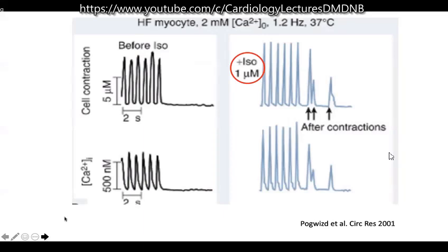Similarly, if you have a patient where the PVC is happening very late after the T wave, in a person who is on dobutamine, 9 out of 10 times, that is delayed afterdepolarization. You are giving too much dobutamine or too much digoxin, and it's calcium mediated. There are specific ionic blockades. For example, carvedilol blocks the calcium release. So looking at the ECG and deciphering the mechanism helps you a lot.